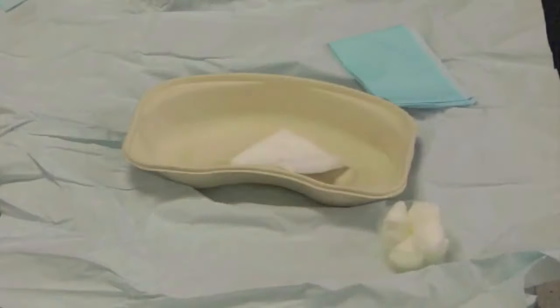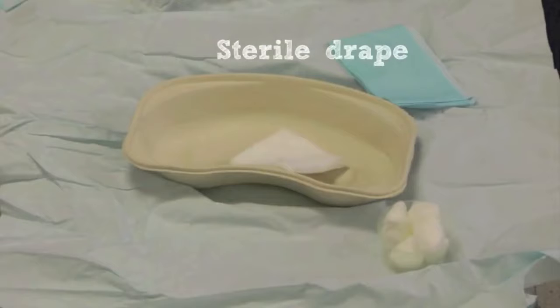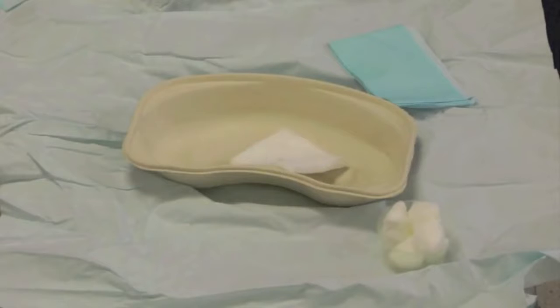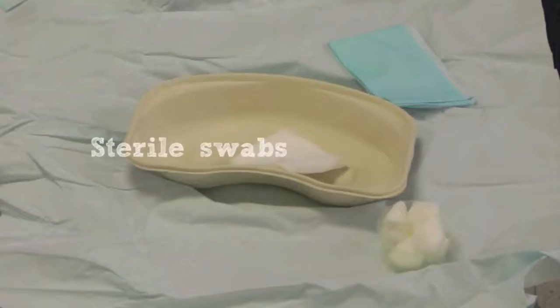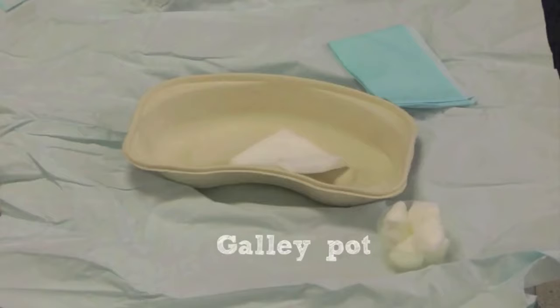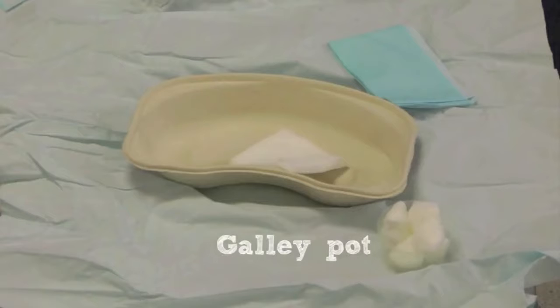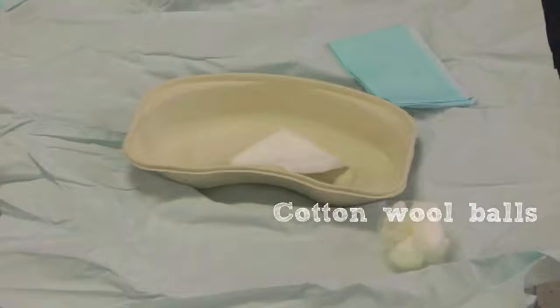The contents of the catheter pack itself are a sterile drape, a J tray, sterile swabs, a plastic galley pot, and cotton wool balls.